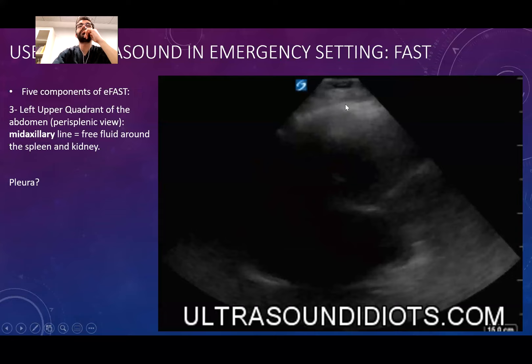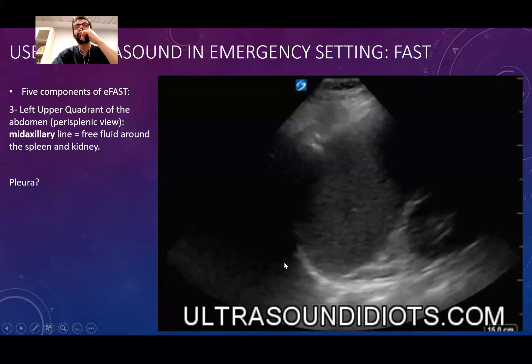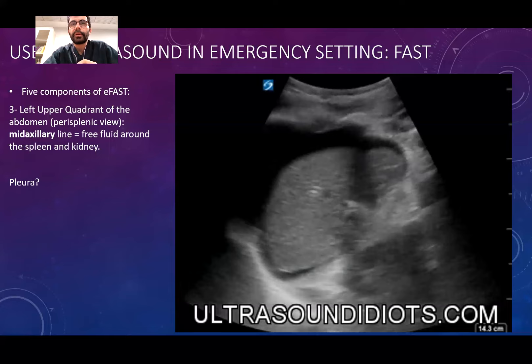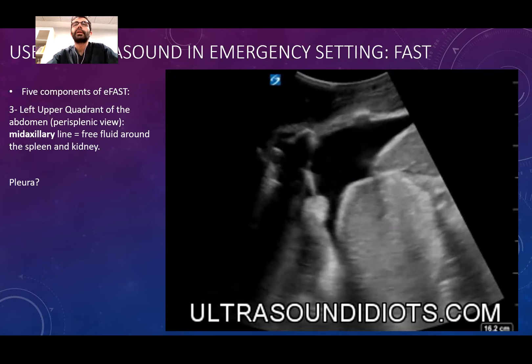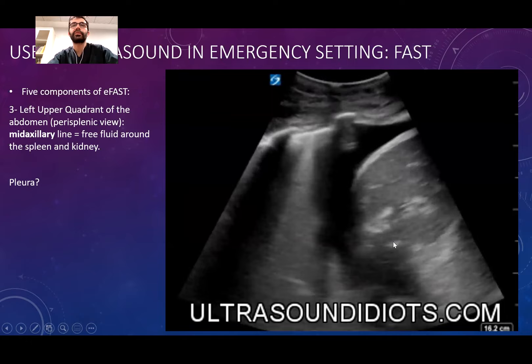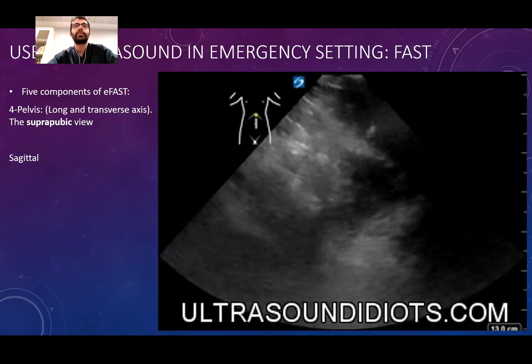Now we have come to the left side. The spleen is smaller than the liver, but looks pretty much the same. We see the left kidney and the spleen. On top of the spleen we see the same pleural lining — the left lung. In the abnormal case, I can see free fluid around the spleen — the spleen is swimming inside the fluid. In another case, the lung itself is swimming inside pleural fluid.